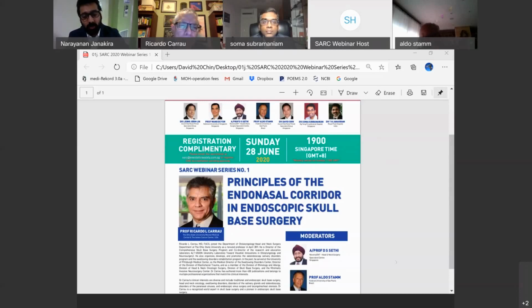My second part of the question was just to address that. Karl Storz is bringing out a camera called the Rubina, the next generation camera, where you can change the mode to see the vessel which is supplying the flap. So you mean by using ICG or without? Using ICG. Yes, we have done that. I think that's useful. We don't use it all the time, but in cases where you have some question, it will be useful. The problem is that you have to raise the flap completely to be able to know whether or not you have viability, right?